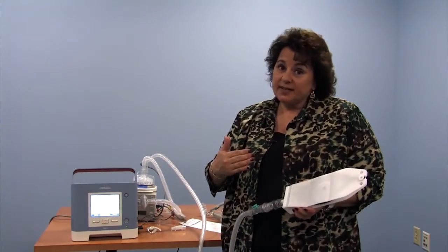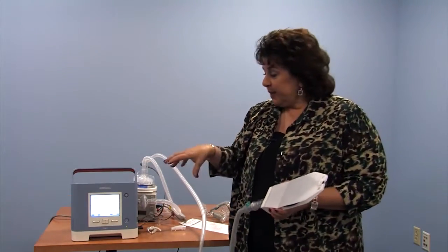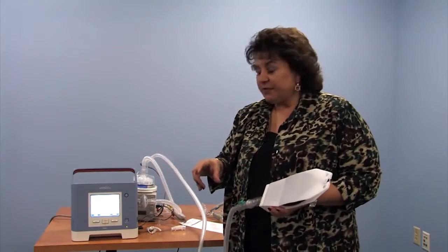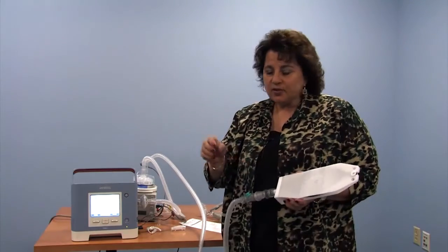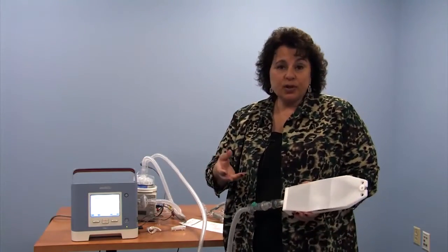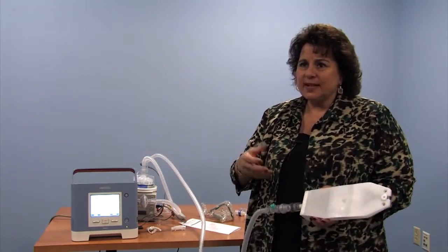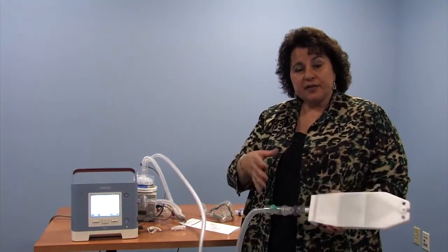I've been advising the families of children I care for to take a picture. If they have a smartphone that takes photographs, take a picture of the front of the machine so that you can have the numbers right with you. We can certainly write them down and put them on your medication list in the bag that you take out with you when you leave the home, but it seems that these days everyone has a smartphone that takes pictures. You can even take a little video clip of it running so that the caregivers can see.